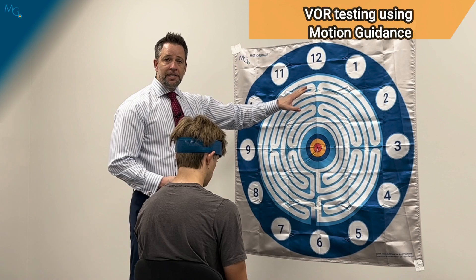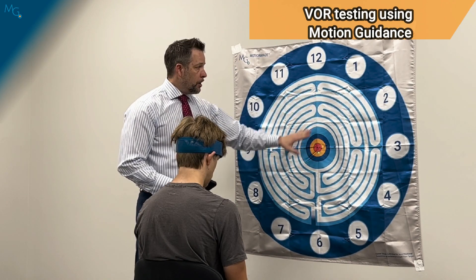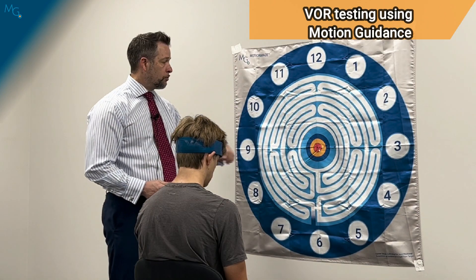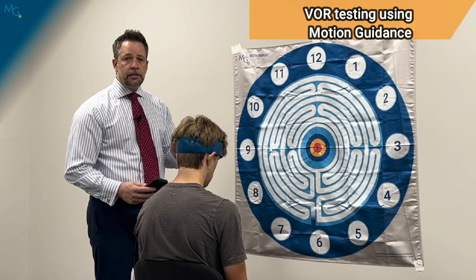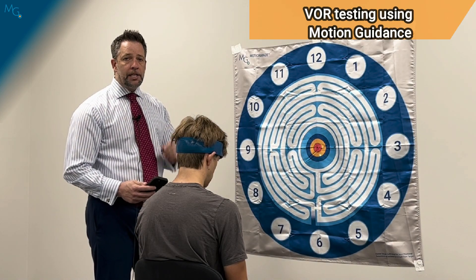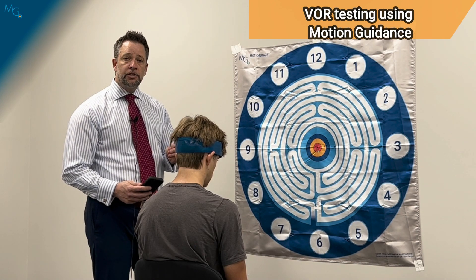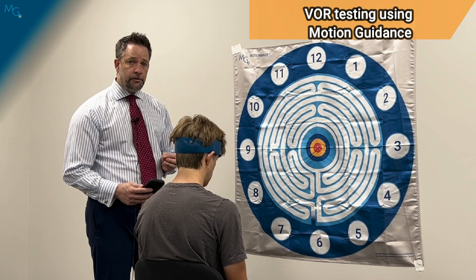We can use the same setup for the vertical plane, which will be performed up and down within 20 degrees of motion or one foot from the center of the target, looking for incongruencies, asymmetries, or possible insight into something not happening appropriately during the test — again suggesting an element of a false negative if they don't have symptoms.